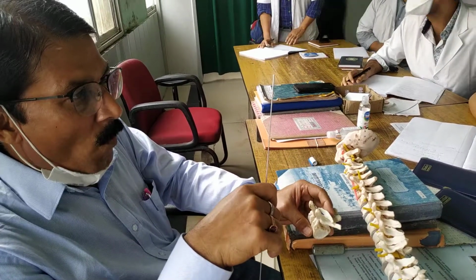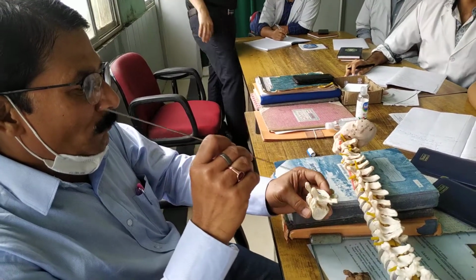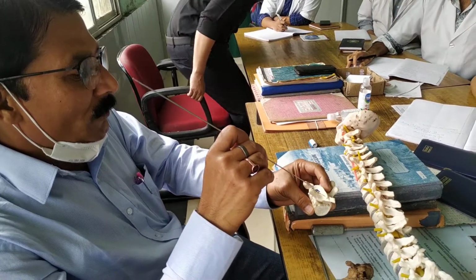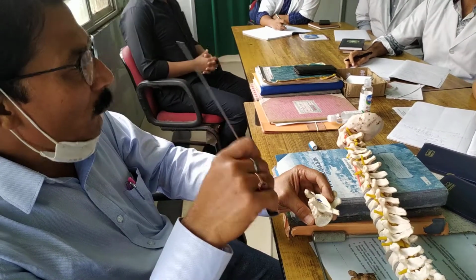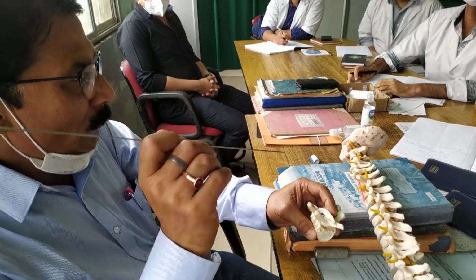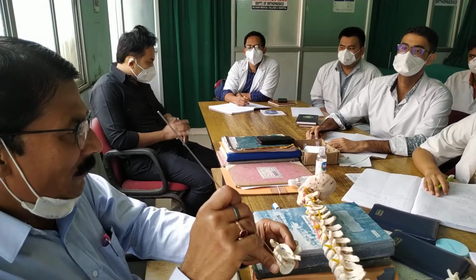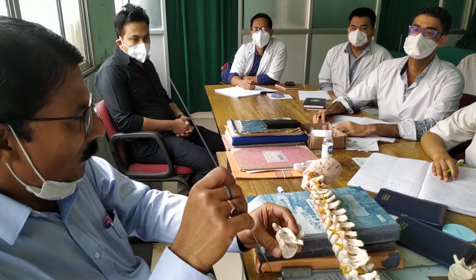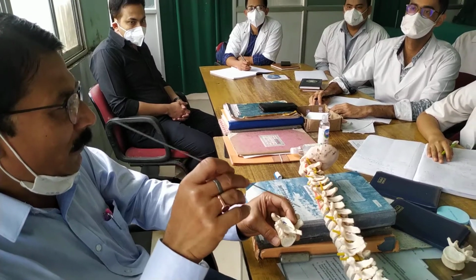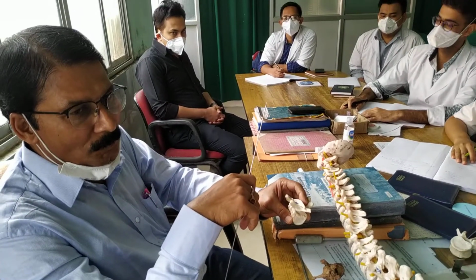Okay? Basic points have been covered: how to find the entry point, how to do the de-roofing, how to find and make the track, and confirm the track with your sound to have the bony feeling everywhere, and then go for the screw fixation.